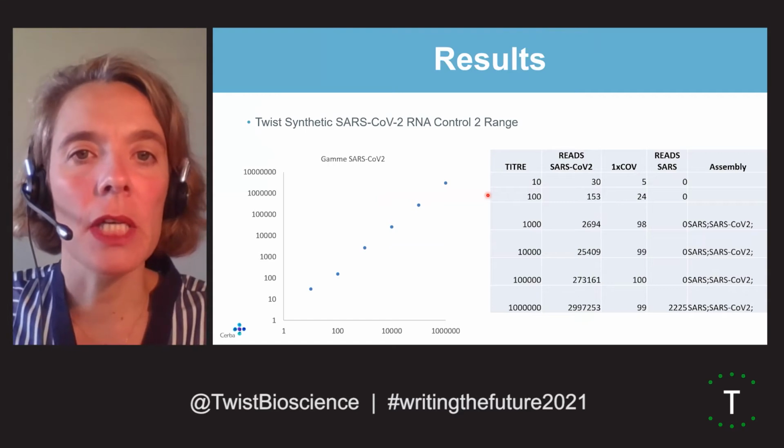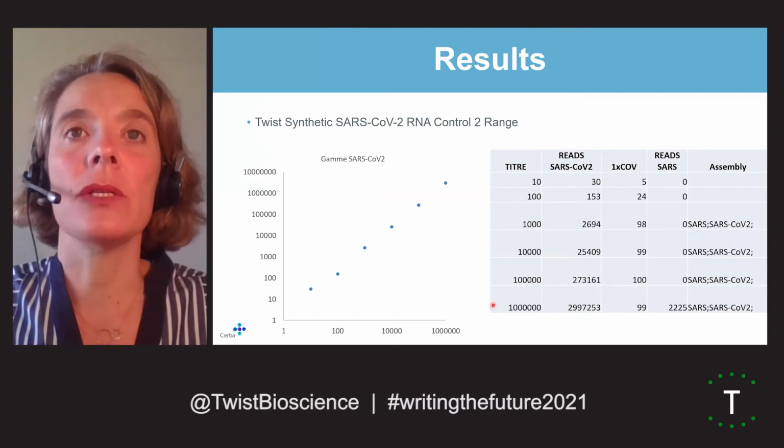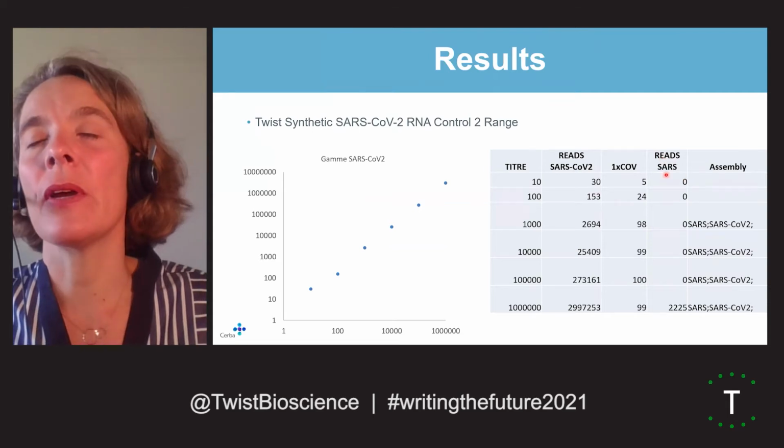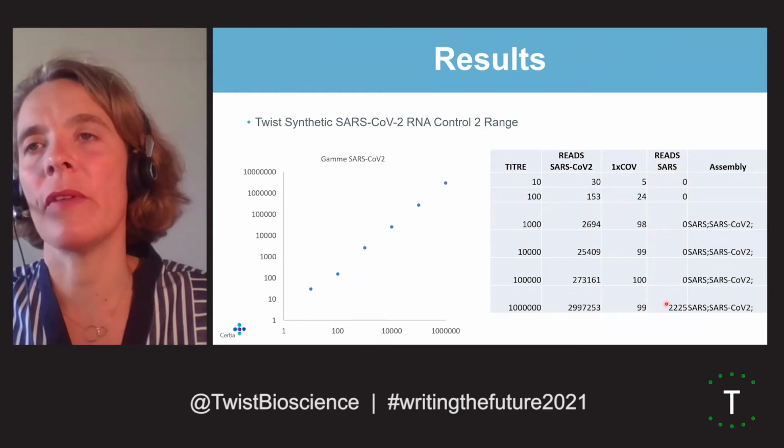We obtained expected results with an excellent specificity, as you can see on this table, between the SARS-CoV-2 and a virus very close to the SARS coronavirus.